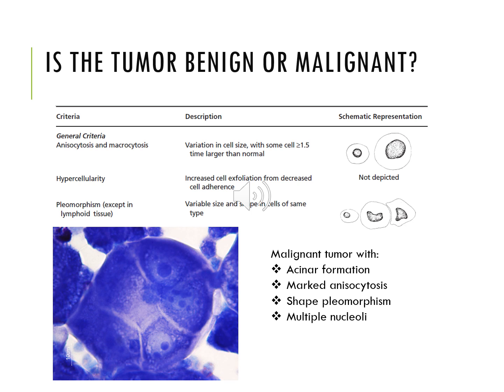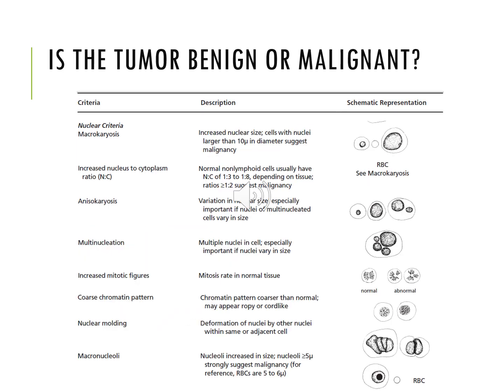They're not uniform at all, and they're forming what's called an acinar formation, which is this circular formation. These are very common in carcinomas, actually. So these are just some criteria of malignancy that we look at when we're assessing cells on cytology.